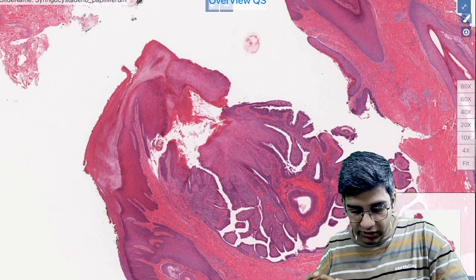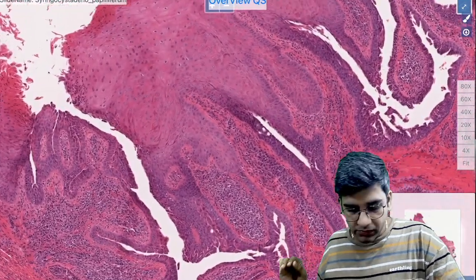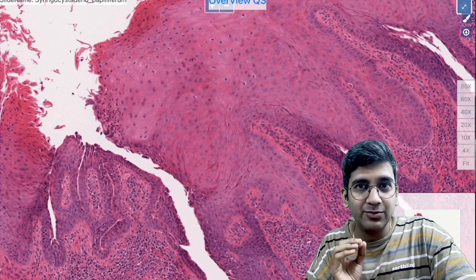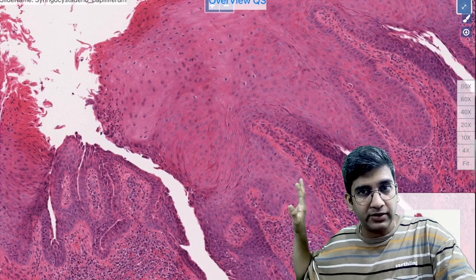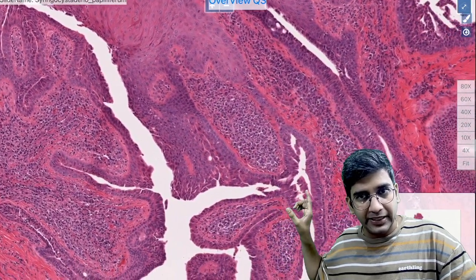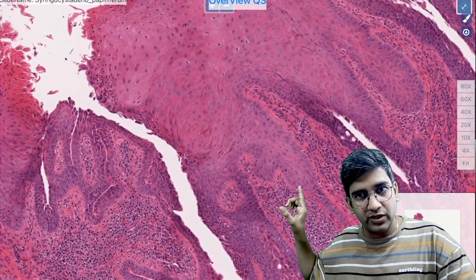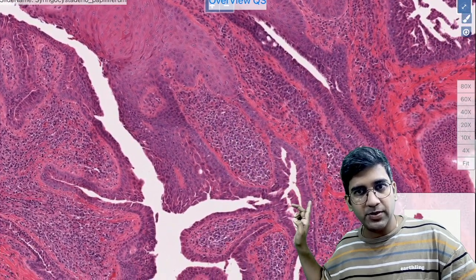If you carefully look at the growth, let's zoom it a little bit. I hope you can appreciate that. Perfect. Okay, there'll be a gradual transition, right? It's clearly said in every standard book of dermatopathology that there'll be a gradual transition from a squamous epithelium, like you can see that, right? The squamous epithelium, there's a gradual transition from the squamous to a double layered epithelium when it goes into the lesion, right? Can you see the transition? That's a beautiful transition, right? The squamous here, agree it's squamous. When it goes deep here, it's becoming double layered.